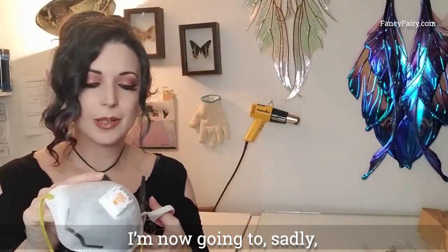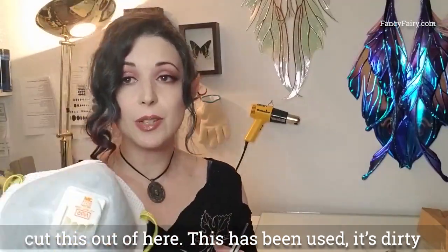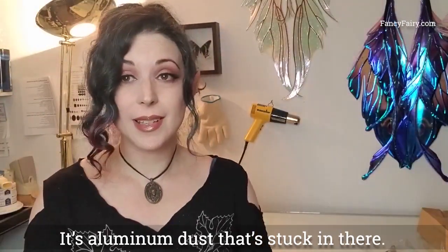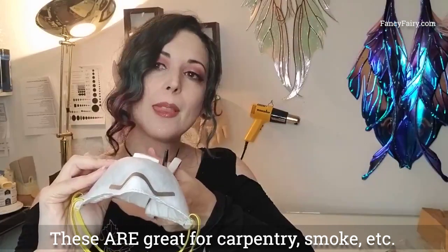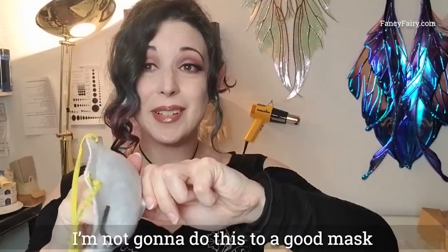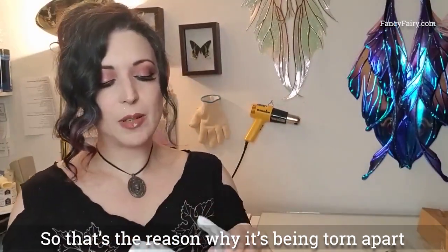I'm now going to, sadly, cut this out of here. This mask has been used — it's dirty, it's aluminum dust that's stuck in there. I'm not going to do this to a good mask. This one was ready to be thrown away, so that's the only reason I'm going to tear it apart.